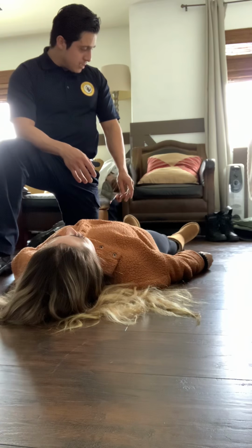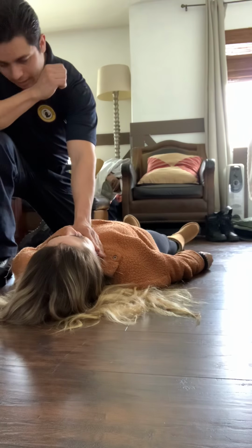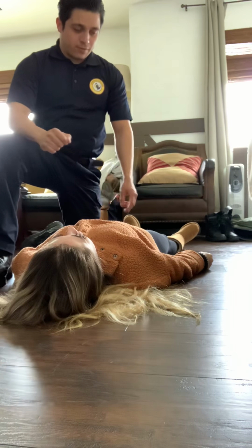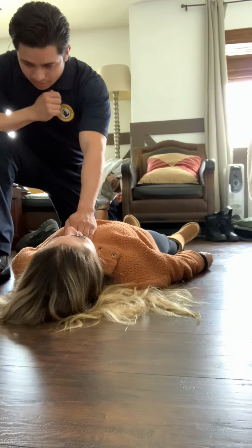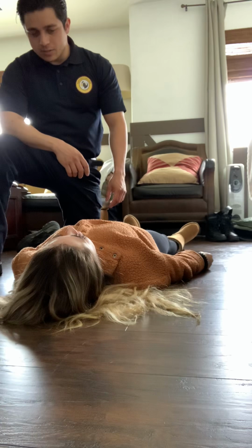Now, I'm going to go ahead and advance to my ABCs, starting off with airway. Is her airway clear? Airway is patent. Okay, going to go ahead and check for lung sounds. How are my lung sounds? Lung sounds are short and shallow. Okay, I'm going to go ahead and provide O2 therapy through a non-rebreather mask at 15 liters per minute.